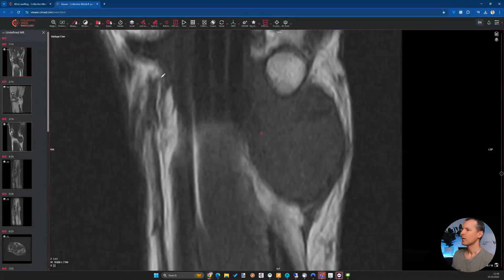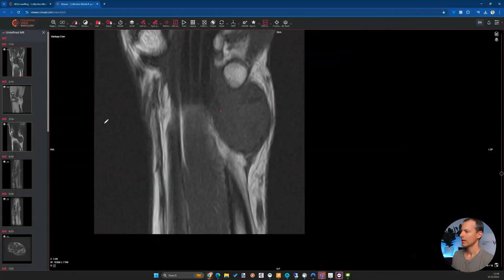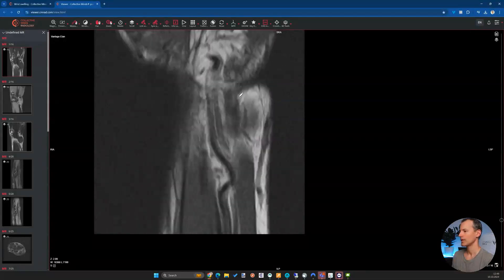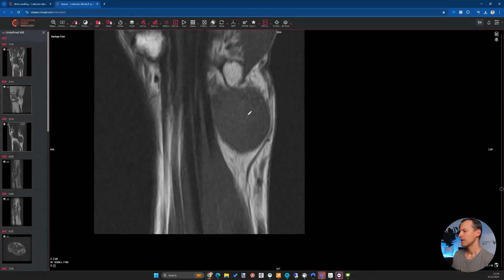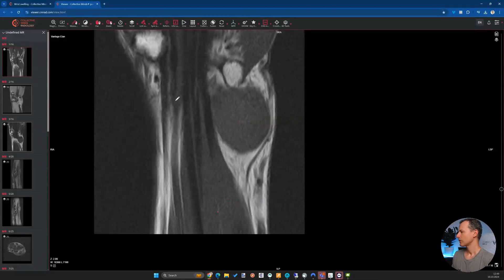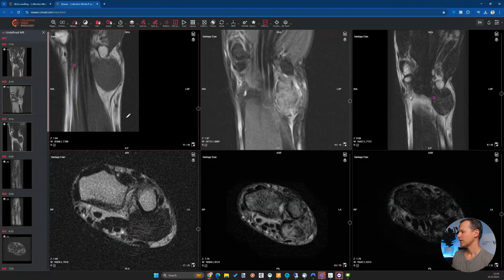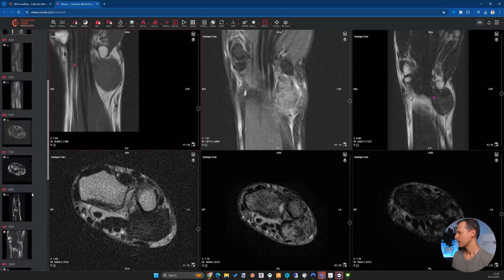We can easily identify the mass here — that's not the diagnostic challenge. We can see there's a big mass on the volar ulnar side of the wrist, sharply delineated, with T1 muscle iso-intense signal. The muscle signal is quite the same as the mass, and we want to check the other sequences too.